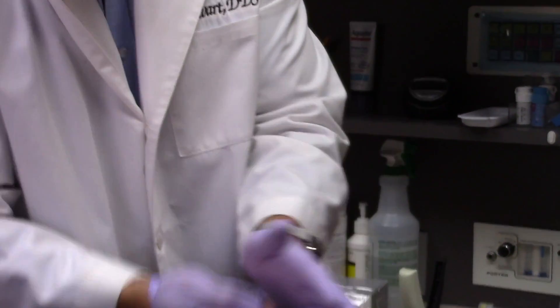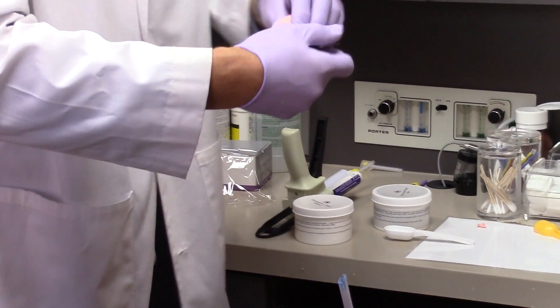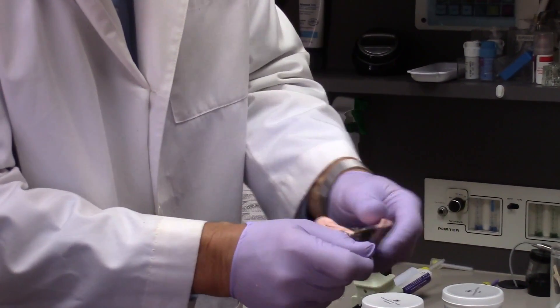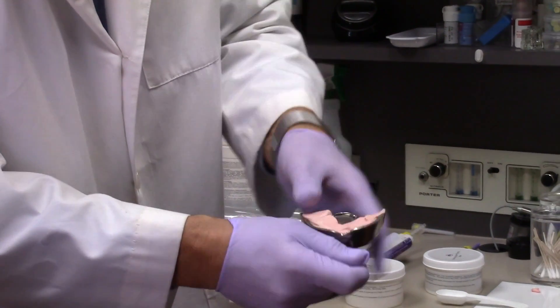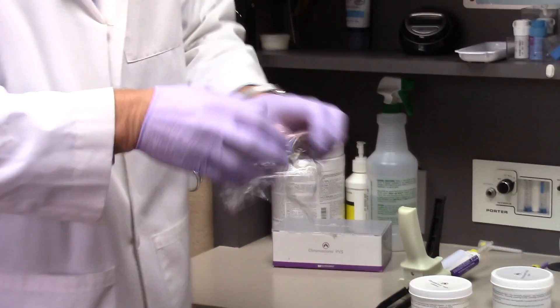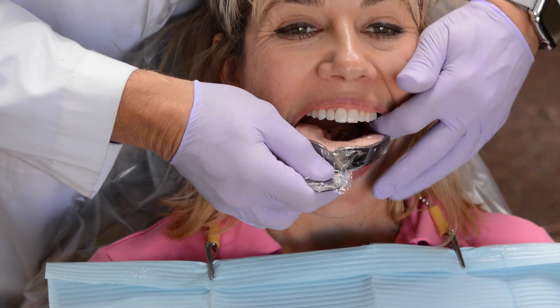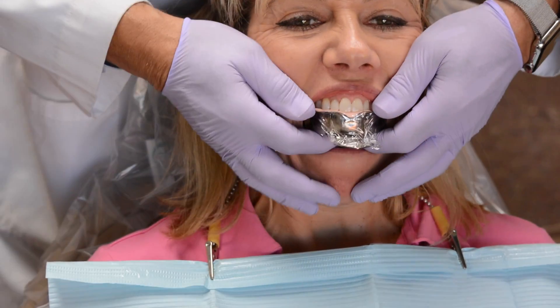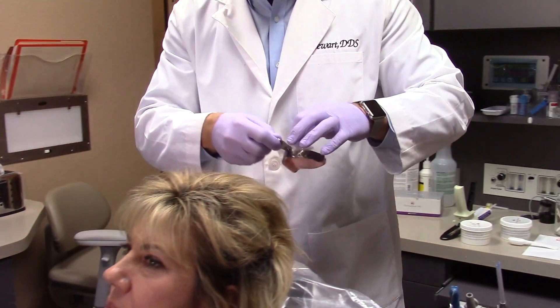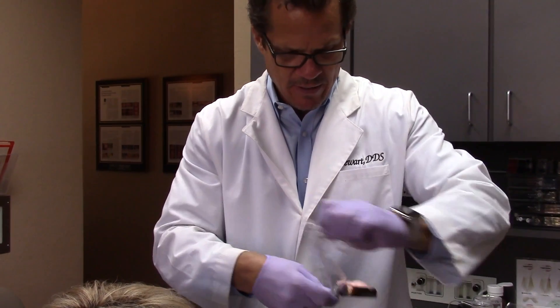There we have it — a nice uniform mixture. We've already tried this tray in on our patient Ann and we don't need to do a palate. The palate is not important for this. We put a little piece of cellophane over and then we're going to go into the patient's mouth. We push straight up, and that leaves us a little indentation for which we can now place our wash.